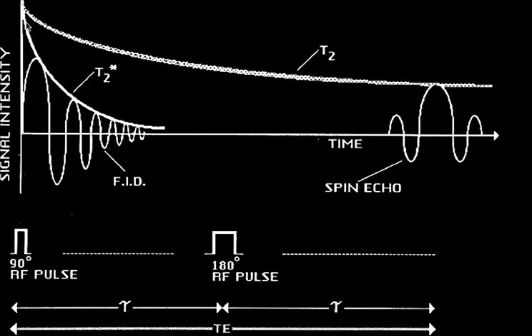And it turns out that T2 star is the sum of both of them. So T2 star is typically in biologic tissues much faster than T2 because most of the inhomogeneities in biologic tissues are fixed and stay the same over time, which is nice for us because we can get rid of those and just see the T2 time changes.